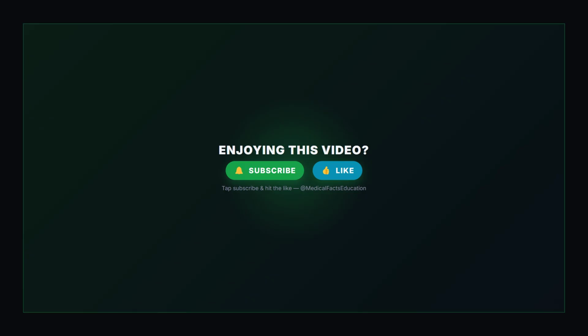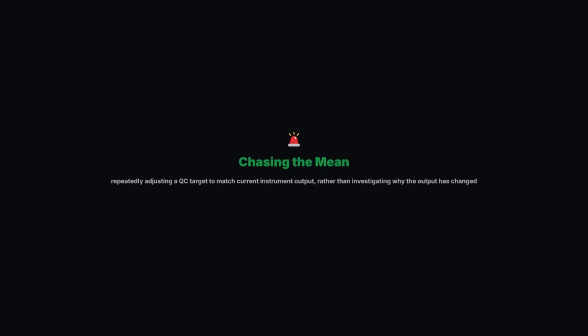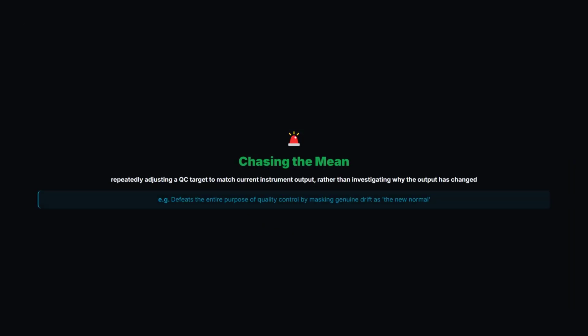This practice has a name among QC specialists: chasing the mean. Each time the target is nudged to match the instrument's current output, any genuine systematic drift gets silently absorbed into the new normal, which means the QC chart stops being able to detect the very problem it exists to catch.